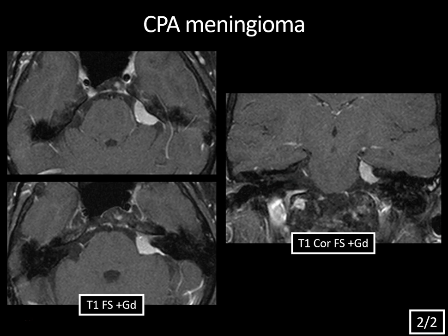Meningiomas are the most common extra-axial tumor in adults, but only about 10% occur in the posterior fossa. They usually occur along the falx, the parasagittal region, and along the sphenoid wing. They're extra-axial — outside the brain parenchyma — and they classically have a tail of dural thickening, which you can see enhancing here. Notice also that this extends slightly into the left internal auditory canal but is not centered within it like the vestibular schwannoma was, and it's not expanding the porous acousticus.